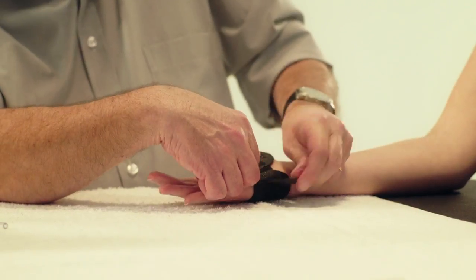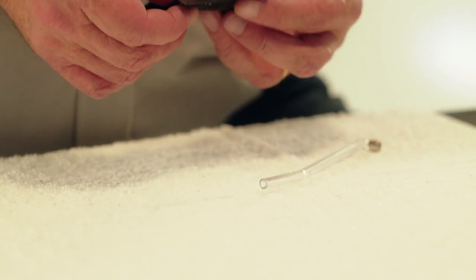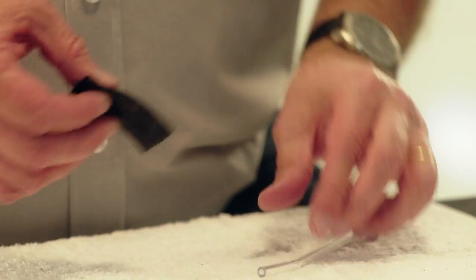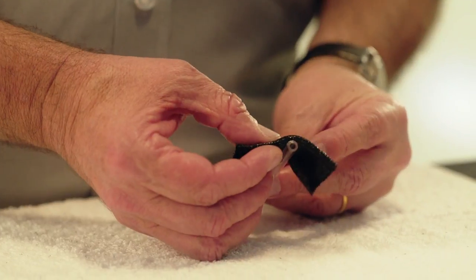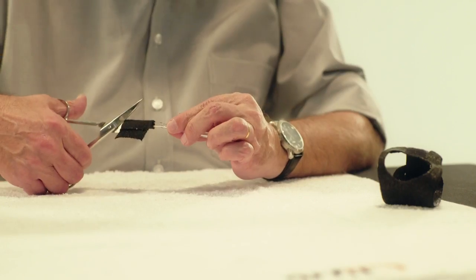Remove the orthosis from the hand. Attach the Orphi tube to the orthosis with a small band of dry heated OrphiCast. Wrap the OrphiCast around the Orphi tube and cut any excess material.